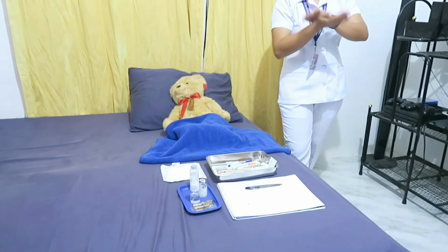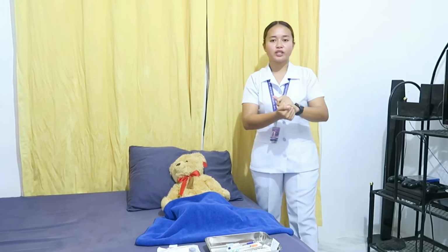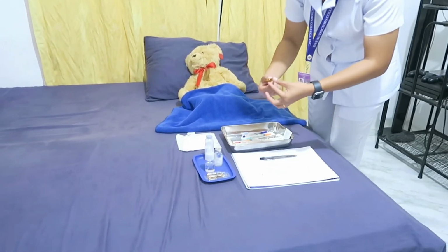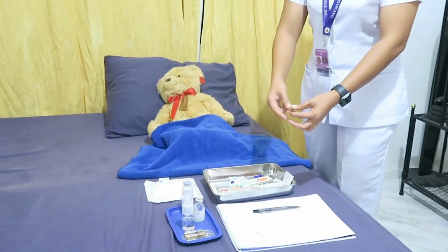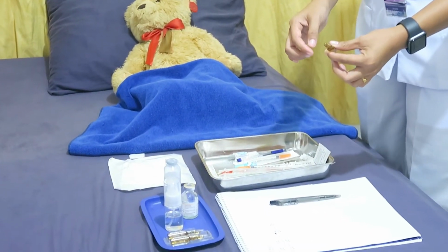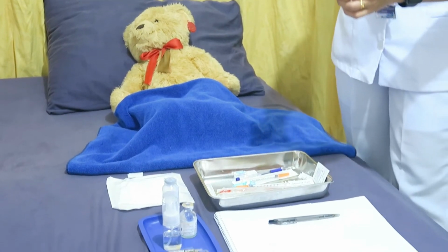And after that, prepare the medication ampule for drug withdrawal. This is because the outside of a new needle is free of medication. So, this is our ampule. Then, flick the upper stem of the ampule several times with a fingernail. So, this.